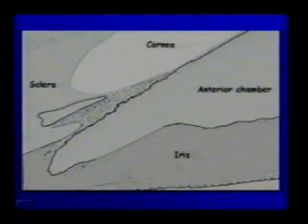This is the angle. With a narrow slit, here is the light on the internal surface of the cornea, and here is the light on the external surface. This is the transparent cornea — both lights meet here at Schwalbe's line. Here we have the opaque limbus, so Schwalbe's line is expected to be here. The internal light and external light meet here — this is Schwalbe's line, and this is the trabecular area.